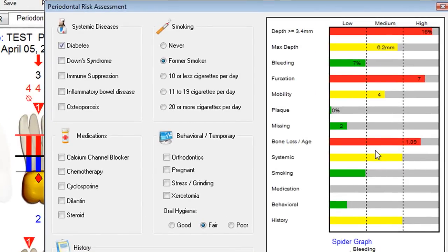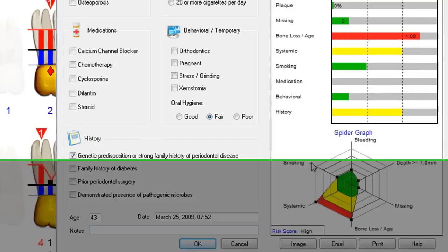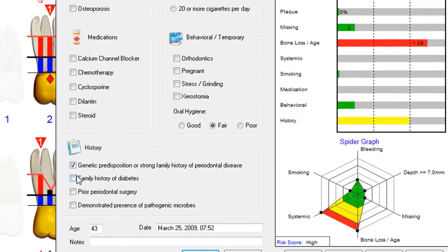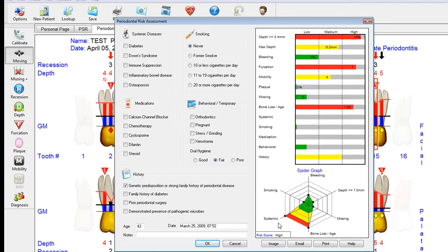This area of the risk assessment is automatically calculated and updated based on the probing data entered each visit. The risk score is automatically calculated as low, medium, or high. This particular patient is a high-risk patient — if they were not diabetic or a smoker, you could change the level. Their level of disease is very high, which is forcing the risk score to also be high. This is one more tool to educate the patient about the disease and the importance of taking treatments.